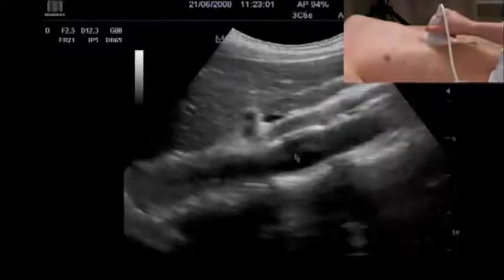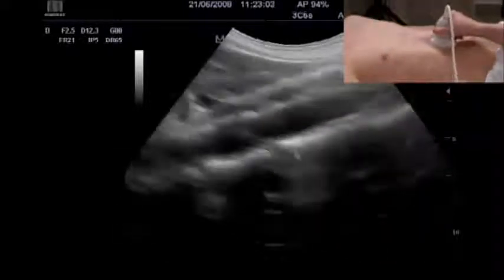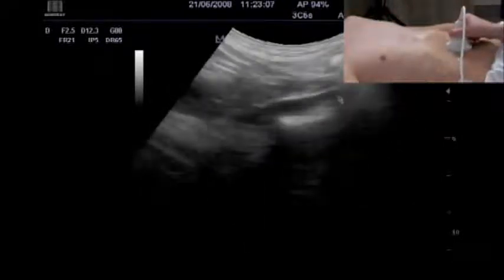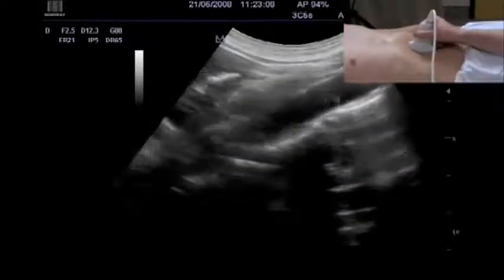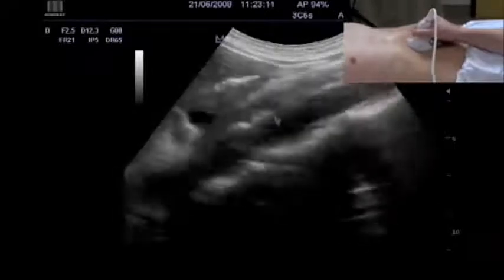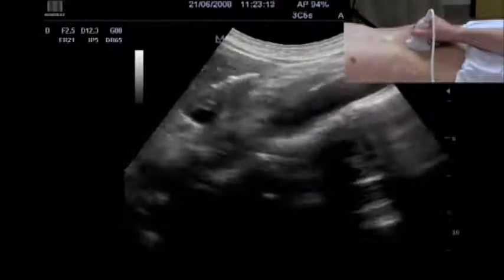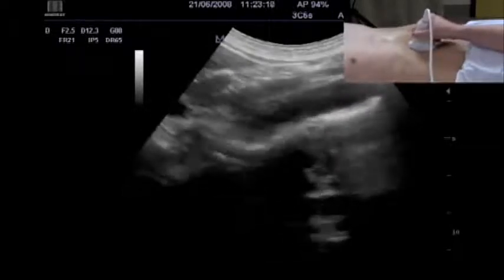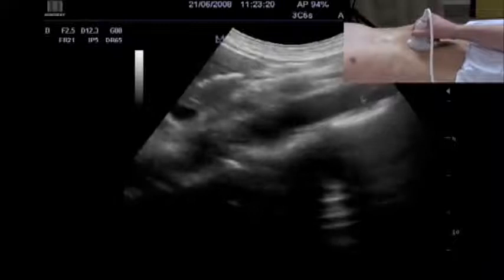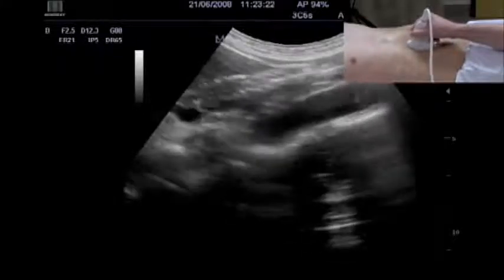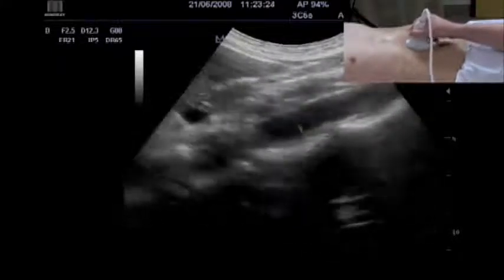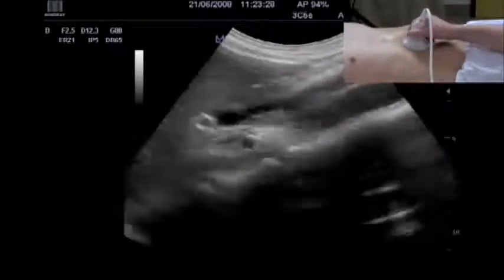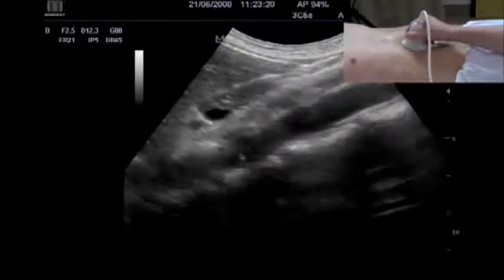Here we see the aorta and we can follow it. One should be aware that the normal diameter of the aorta is declining from cranially to caudally. If this is not the case, an aneurysm of the aorta should be suspected. Here there is a normal decline of the anterior-posterior diameter of the aorta from cranially to caudally.